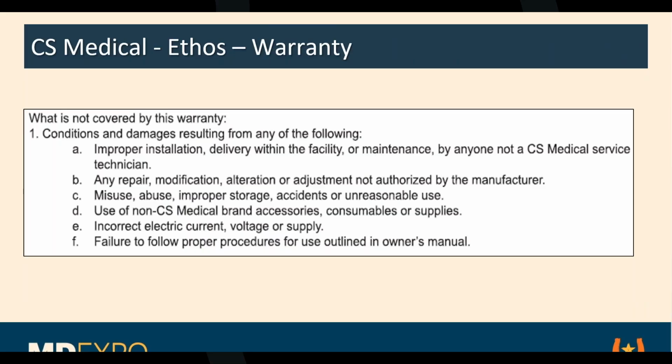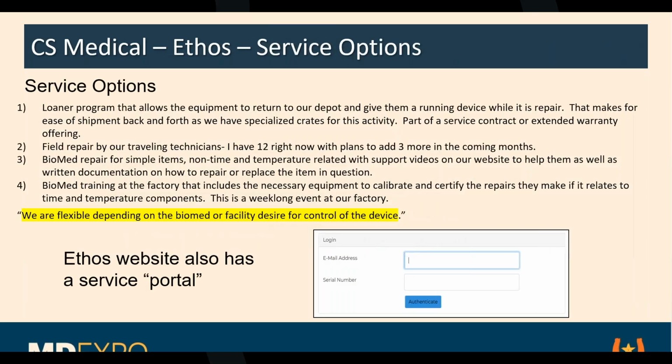Okay, it's 5 to 7 years. 5 years for a TE probe or any other very complex type of probe, 7 years for general probes. And if you just get a probe and you go outside the lines of this and you blow it up, you've done significant damage to your budget.